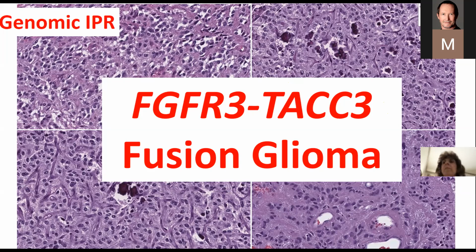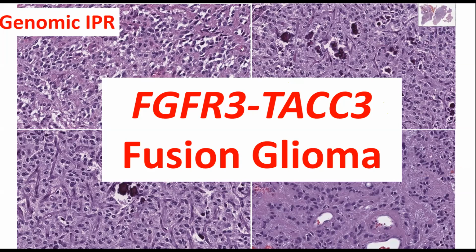So we go to the upper right panel, and what you see is actually more evidence for oligodendroglioma. You see microcalcifications, and if you look in the lower left panel, chicken wire or endocrinoid vasculature, this delicate branching vasculature. Again, that is a feature of oligodendroglioma. So far, you're getting a feel of oligo, but it's not quite right for oligo. In the panels with the microcalcifications, the halos are not classic oligo. They're not prominent enough. Oligo-esque, if you will.